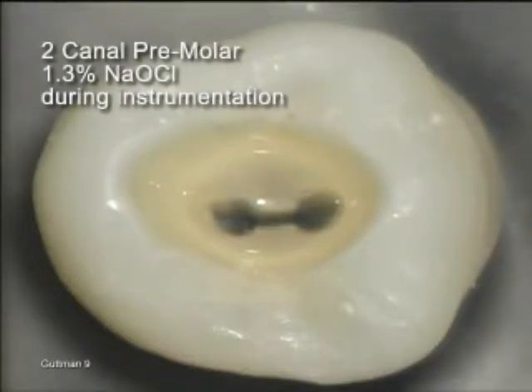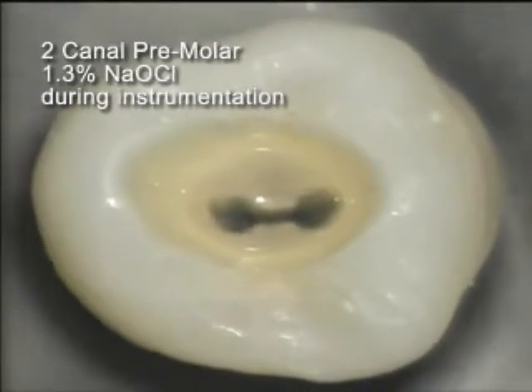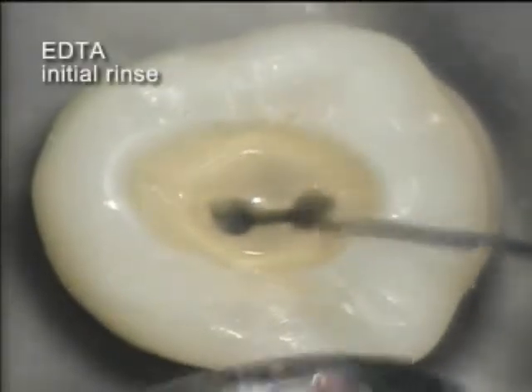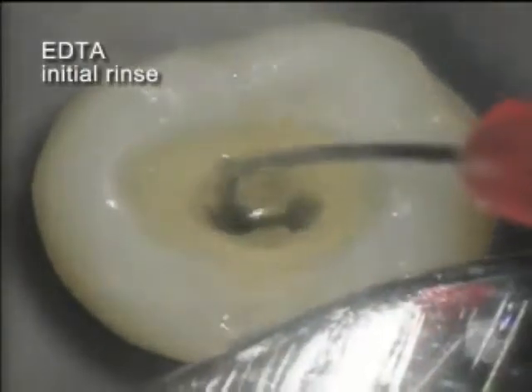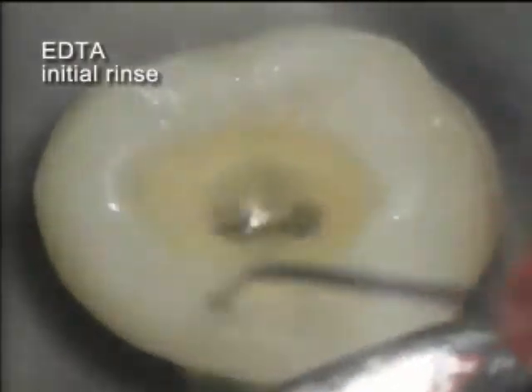This two-canaled premolar was fully instrumented with ProTaper instruments. 1.3% sodium hypochlorite was used throughout the instrumentation process. A 17% EDTA solution is then introduced using a 28-gauge side-vented needle after the sodium hypochlorite.